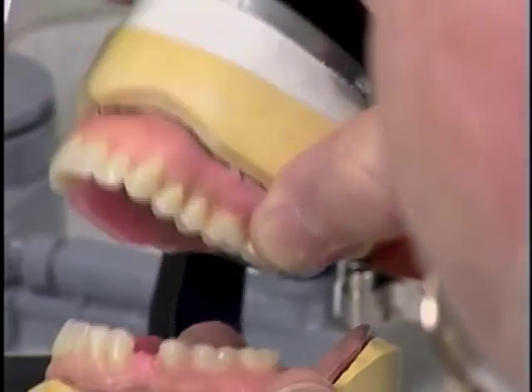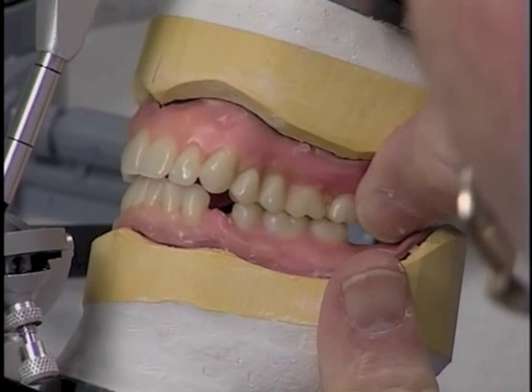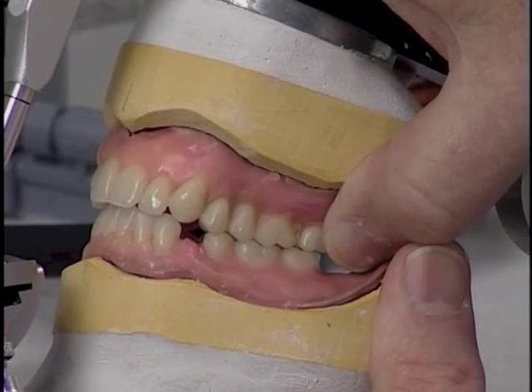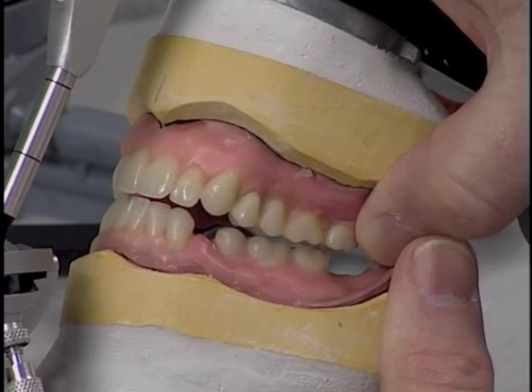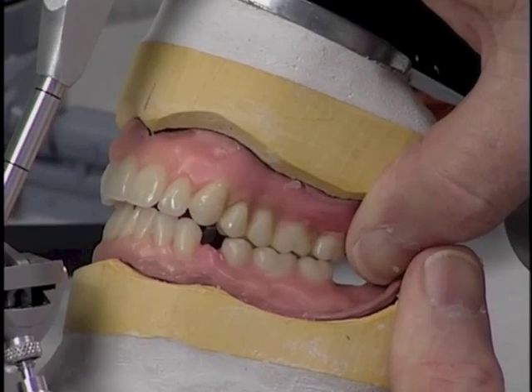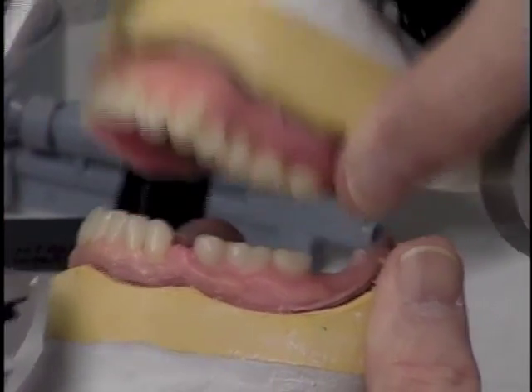Now, as we did with the first molar, we're going to close it in centric relation, move it into working relation, and move it back into balancing relation, and we have pretty good contacts of everything with it like that. I'm well pleased with that.